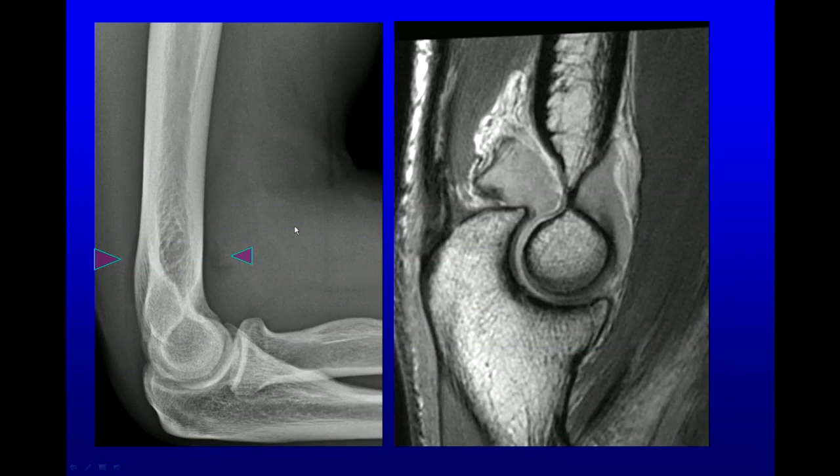On our radiographs, we can see effusions if it's a good lateral radiograph, and we get that anterior sail sign when the fat pad gets raised by fluid underneath. Very frequently, we will see some fat behind the humerus as that fat pad gets raised by fluid. If you see an effusion like this and there is trauma, you should really look for a fracture. If there's no trauma, it's probably synovitis — it could be bloody, or it could be from some sort of arthropathy.